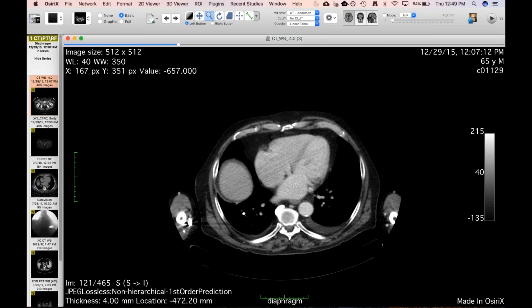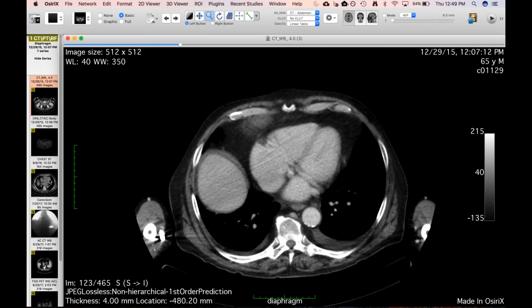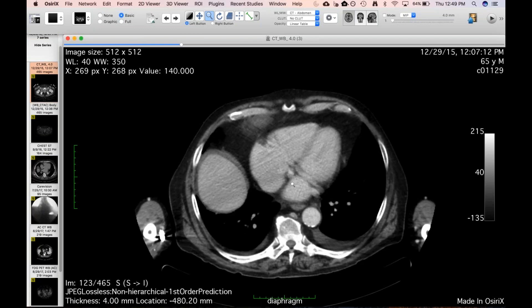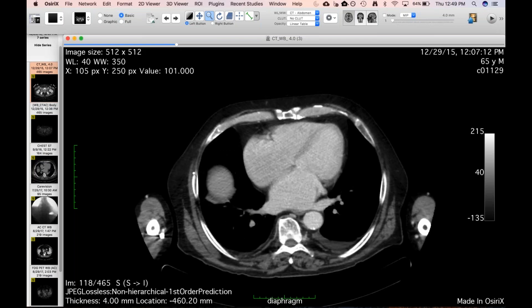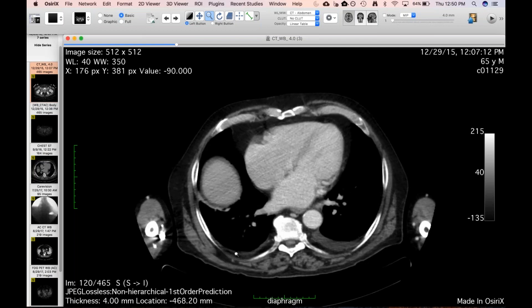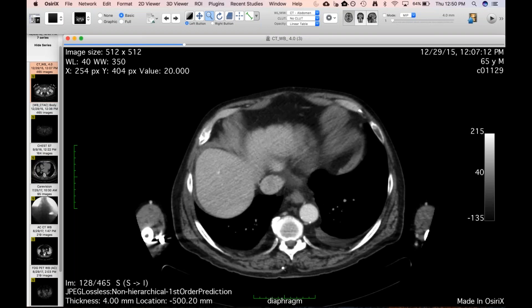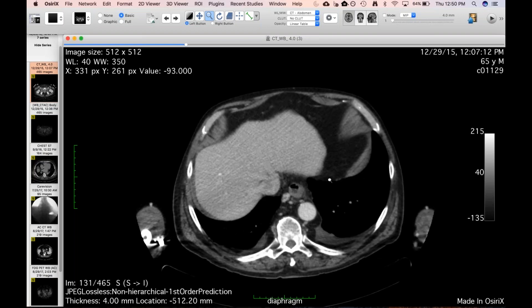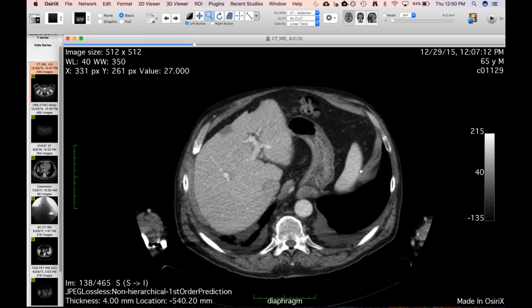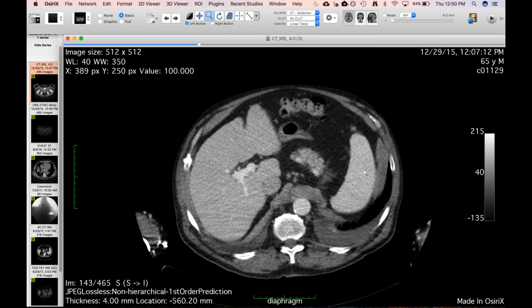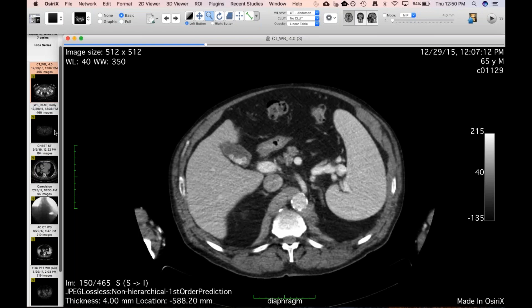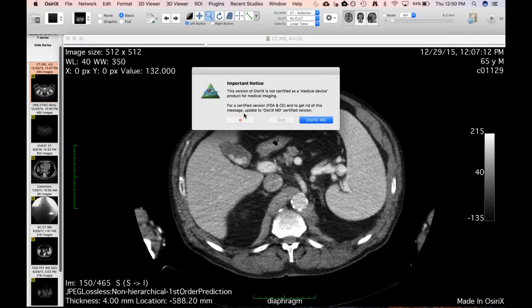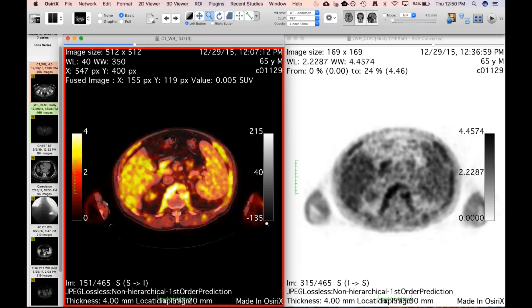We'll visit the diaphragm today. This is a remarkable case I saw a couple months ago — a 65-year-old patient with dermatomyositis who had some weight loss, maybe some B symptoms, and a monoclonal gammopathy. They did a whole body PET looking for malignancy, since patients with dermatomyositis/polymyositis have an increased risk of cancer. Notice his diaphragm, especially posteriorly, looks awfully hypertrophied. He's got a big spleen at this time. When you fuse it with the PET, there's pretty substantial uptake in the diaphragm — it's thickened with increased uptake, and the SUV is as high as about five in the diaphragm.